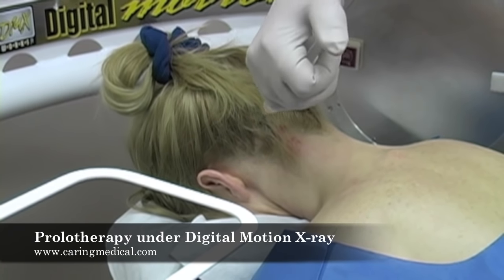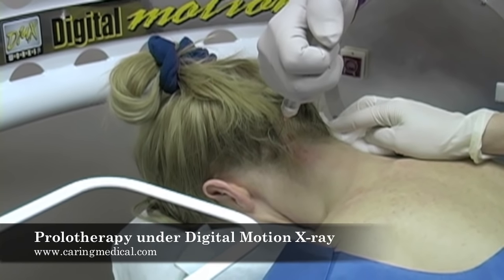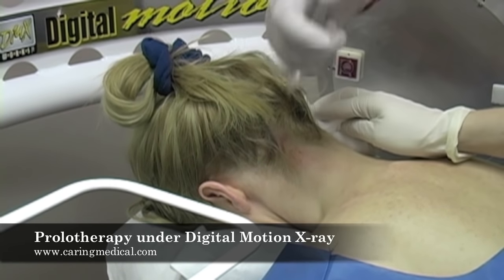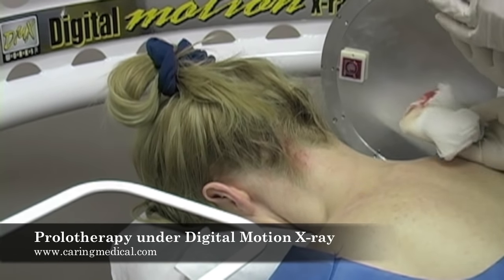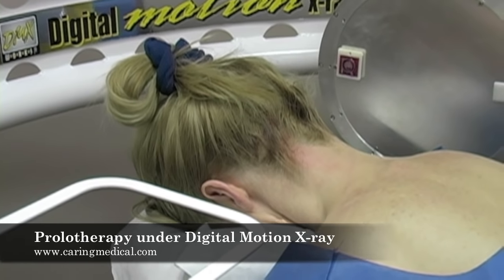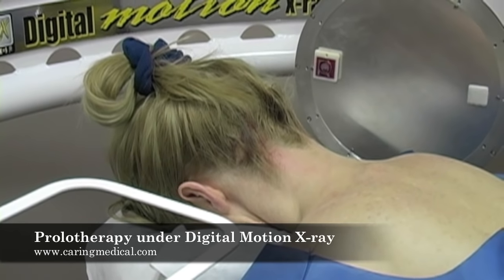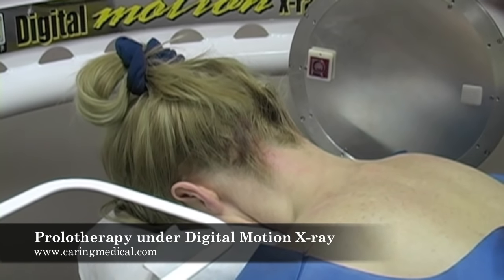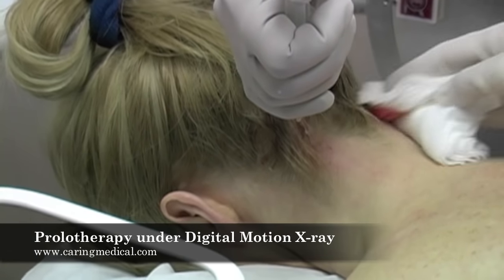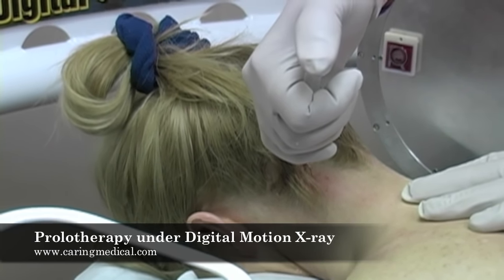You can see this patient is not moving a lot even though there are a lot of injections — it's very easily tolerated and can be thoroughly done in an office setting. I work with an assistant during this procedure, and the post-operative care of the patient is actually pretty minimal. Sometimes we do have them use a cervical collar.